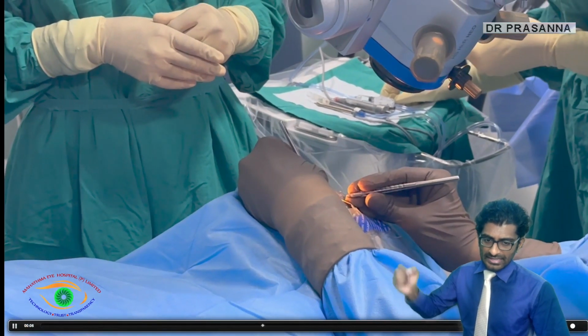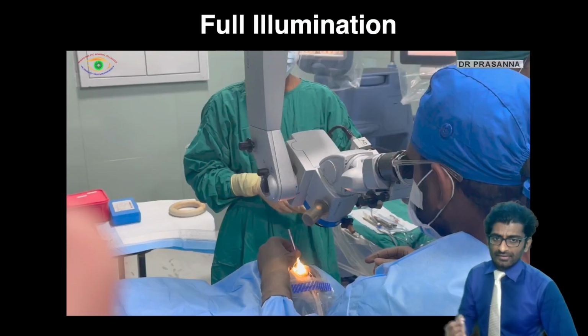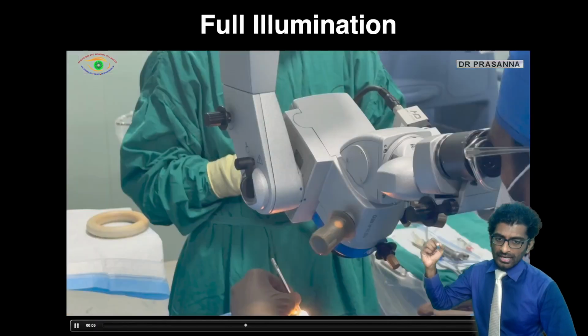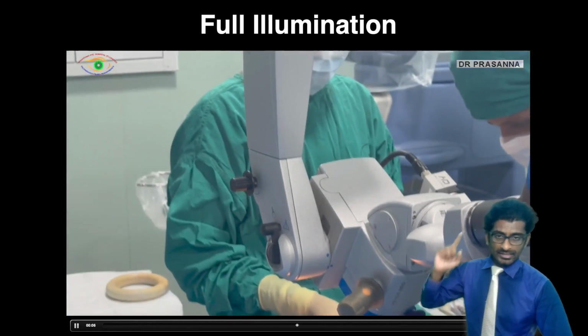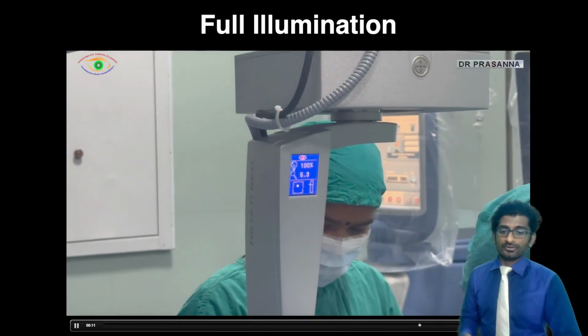You may think your right hand is your surgical hand, but your left hand support is your gonioscopy hand, and it is very, very important. And make sure you have 100% illumination. Again, that is of paramount importance so that you don't have any loss of light or minimal loss of light.